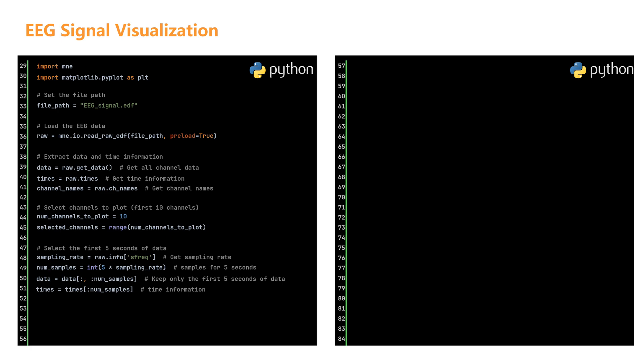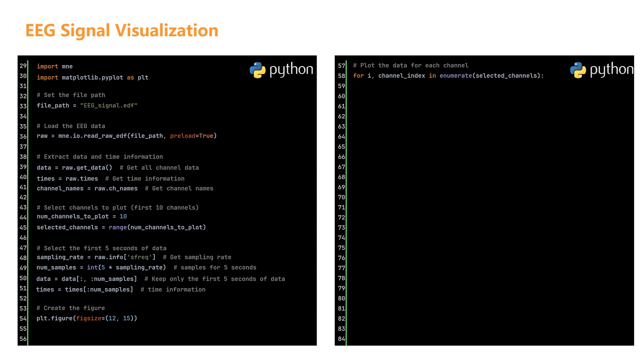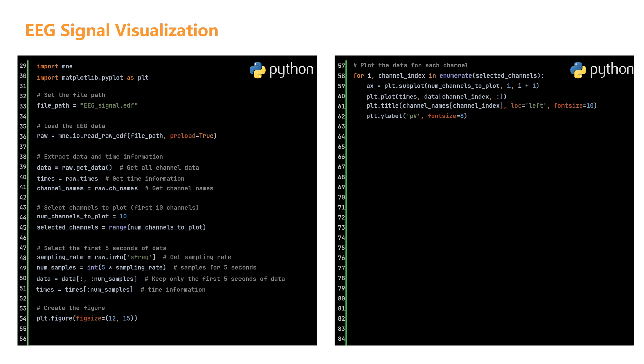Now let's visualize our EEG signals using matplotlib. We'll create individual plots for each of our selected channels. First, we set up the overall figure size using plt.figure. We specify a width of 12 inches and a height of 15 inches to give ourselves plenty of room for all 10 channel plots. Next, we use a for loop to create a separate plot for each channel. Here is how the process works. For each channel in our selected list, we create a new subplot using subplot, plot the signal curve with plot using our time values for the x-axis and the channel's data for the y-axis.